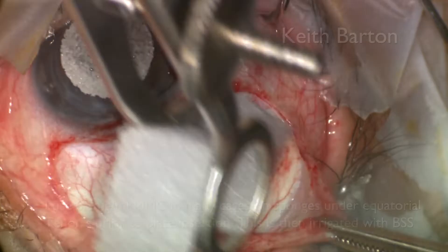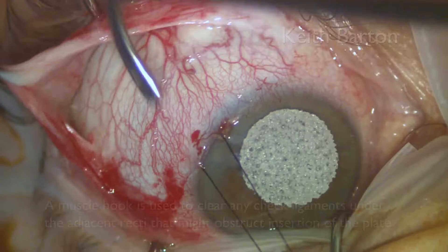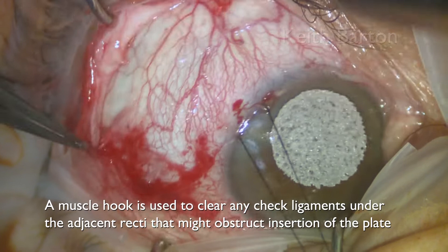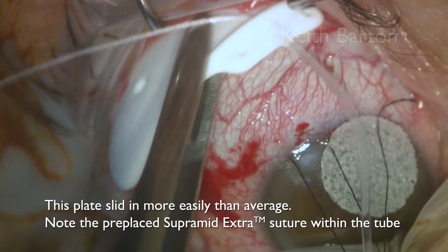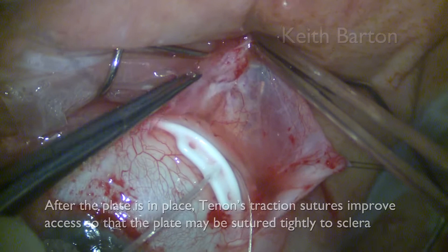I use 0.5 mg/mL of mitomycin in many cases on sponges under equatorial Tenon's prior to plate insertion. This is then irrigated with BSS. A muscle hook is used to clear any check ligaments under the adjacent recti that might obstruct insertion of the plate. This plate slid in more easily than average. Note the pre-placed Supramid Extra suture within the tube.